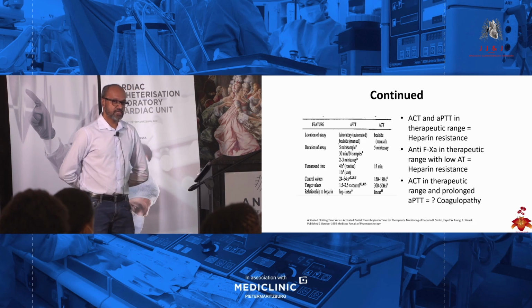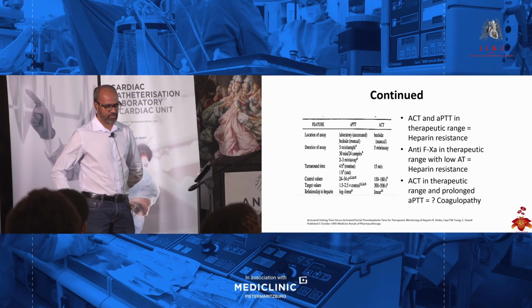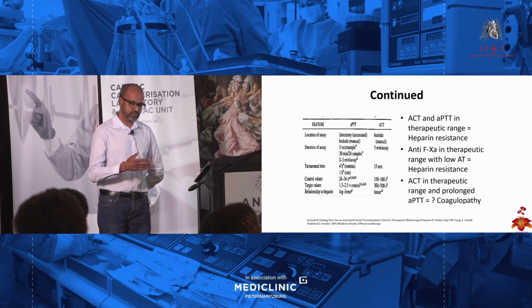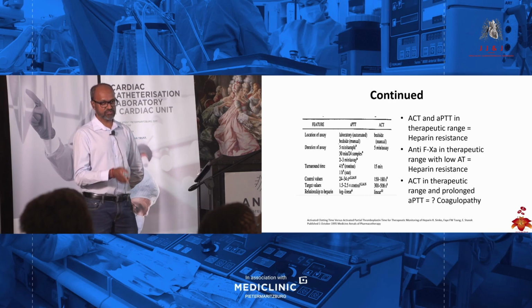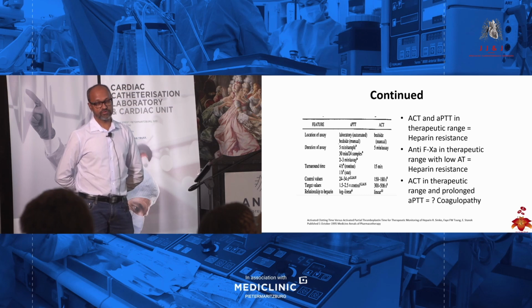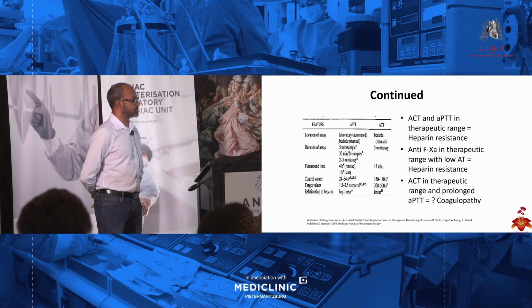If we have a low platelet count and features of thrombus forming in the circuit, then we have to consider: are we dealing with thrombus forming in the circuit, or a DIC kind of picture because of the thrombus in the circuit, or is it sepsis? Now, if it's thrombus in the circuit, we just change the circuit and we're back to normal. But if it's DIC, we need to aggressively treat any infections. So microbiology is important in these patients.